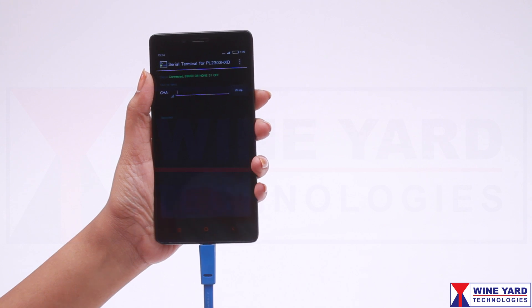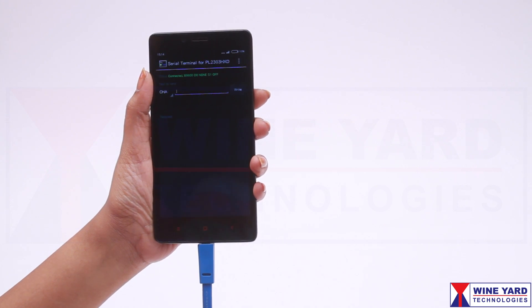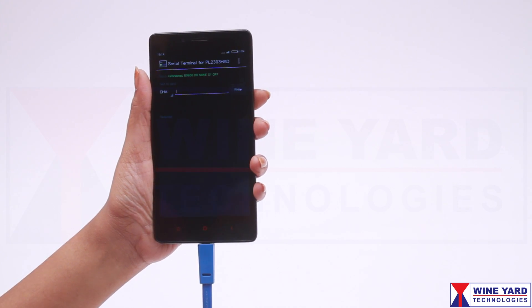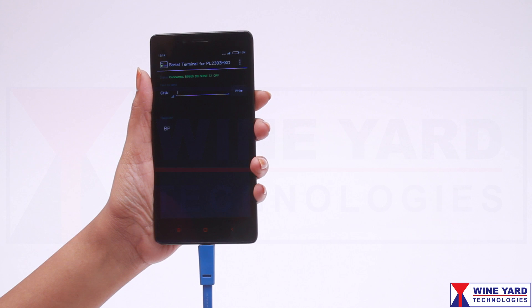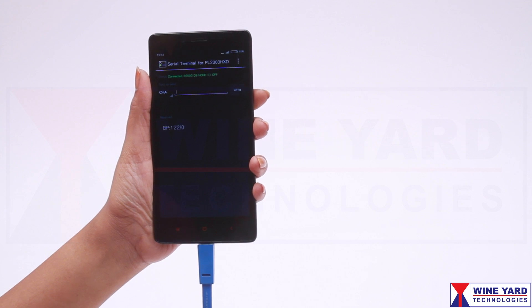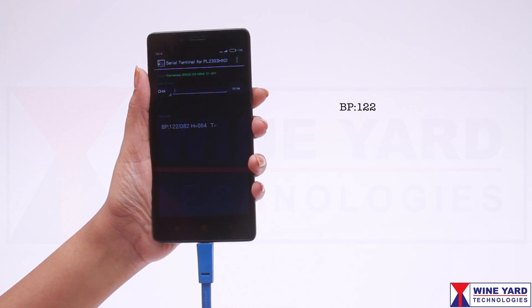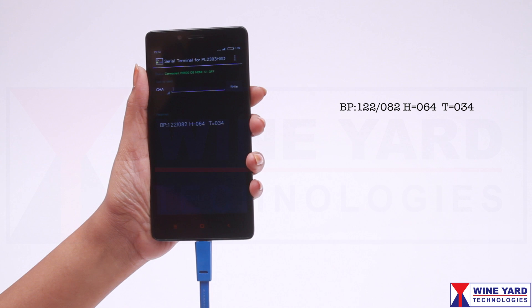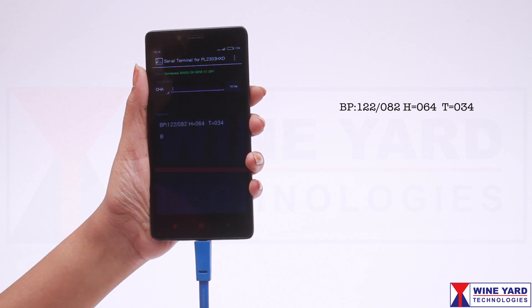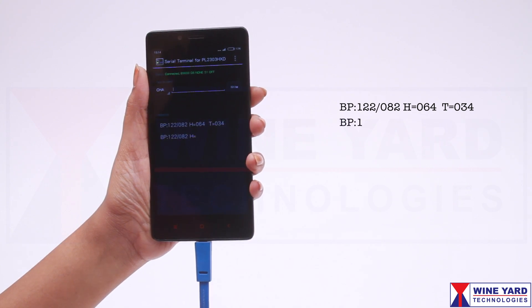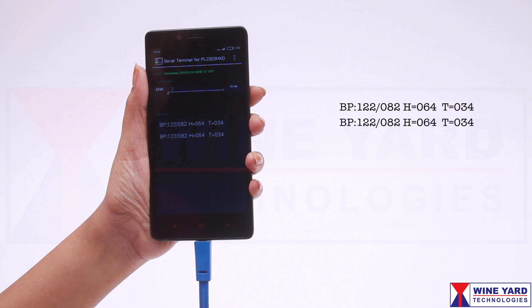This is a simple Android app for serial communication with the Zigbee module. Now the doctor can read the blood pressure, body temperature, and heartbeat from a remote place on his mobile phone, laptop, or computer.